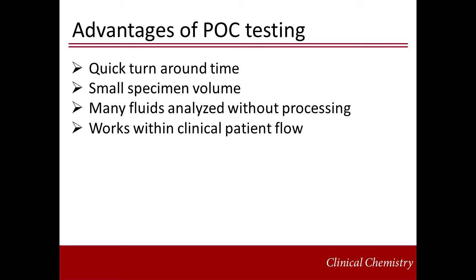Many POC tests use less than 300 microliters of capillary blood or urine. In addition, no processing is required for urine or whole blood. Finally, and arguably the most important advantage of POC testing, is that they provide an avenue to align laboratory testing with clinical patient flow.